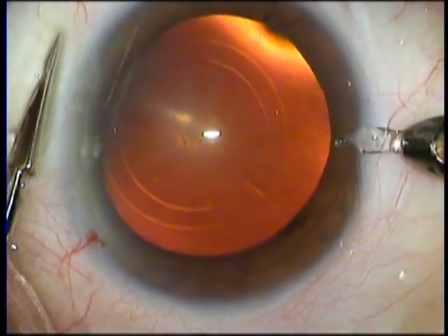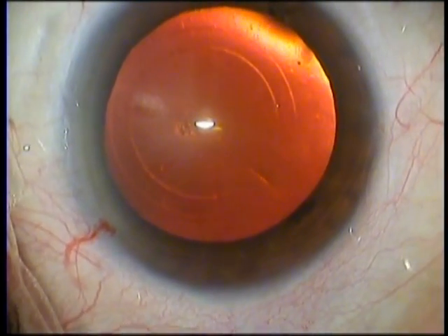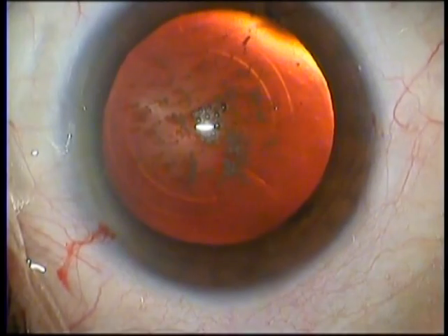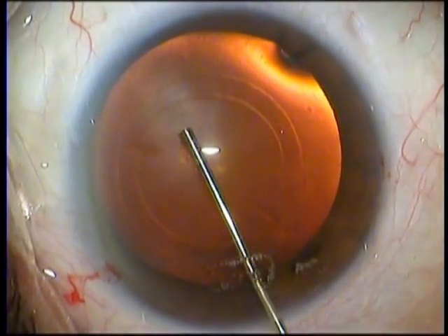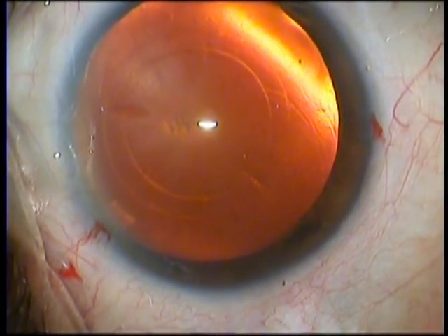If you notice here, the rings are slightly de-centered nasally, because in most people the visual axis is de-centered nasal and inferior. It is my belief that we center the rhexis on the visual axis rather than on the center of the pupil, and to that end we have invented the rhexis marker.